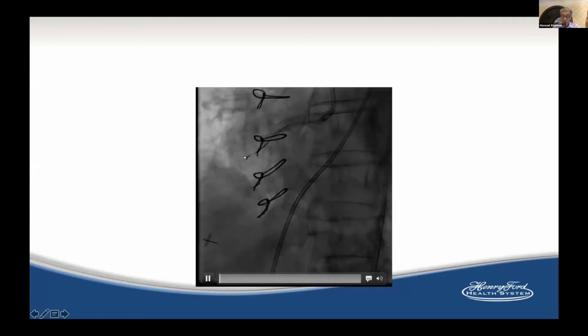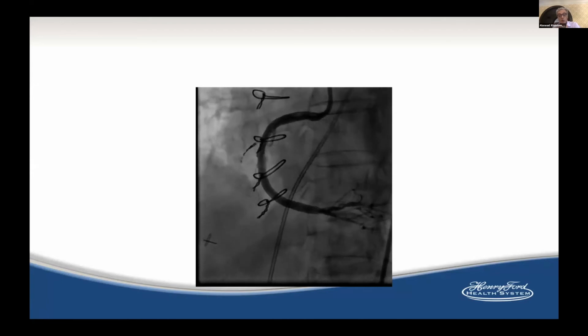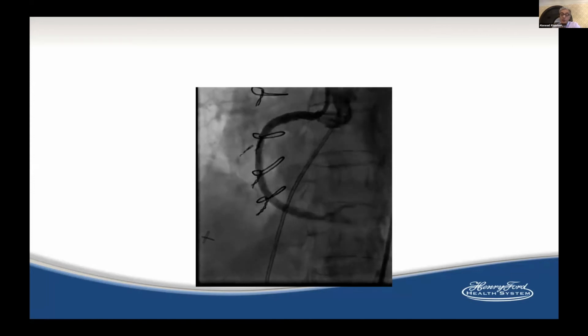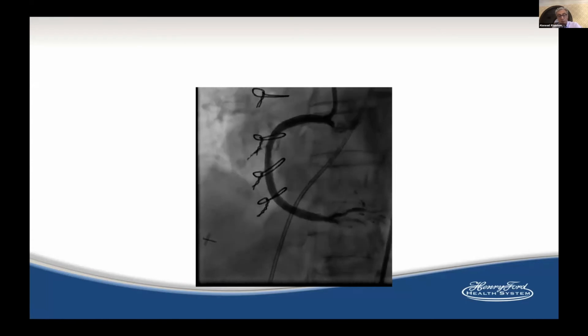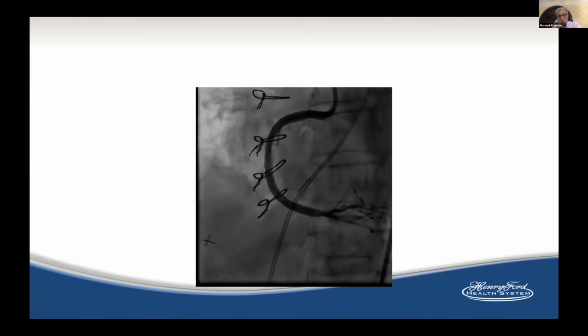So here, a very important point, you have to keep coils that deliver through any microcatheter you have. There are coils that need their special microcatheter. Most of the coils available in the cath labs are 018 or 035. But you need to talk to your neuroradiology colleagues and figure out what they do. You need to know how to deploy the coils before you start doing any CTO procedure. It's very, very important if you're doing high-end techniques to know how to deliver a coil. So if you don't know, you can call the reps, and they will come and show you and deploy a couple of them on the table.